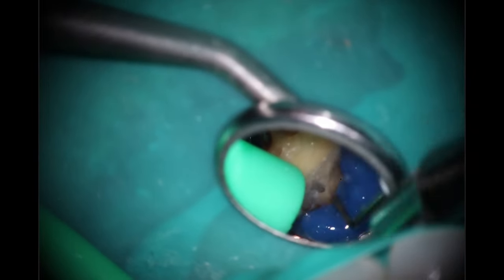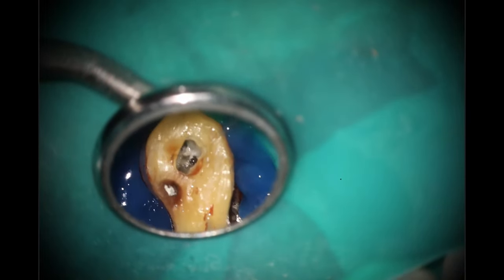All of that inflammation there is from the pulp tissue itself — it's not from the gingiva. You'll see once we get it cleaned out that it's covered by that block-out resin. Rinsing that out here just to confirm. And you can see the gingiva actually is very healthy. That's the one thing about palatal tissue — it is very tough, thankfully. So having a little bit of access trouble here, I'm going to go back in with my workhorse, that 850 diamond, just to refine the access.